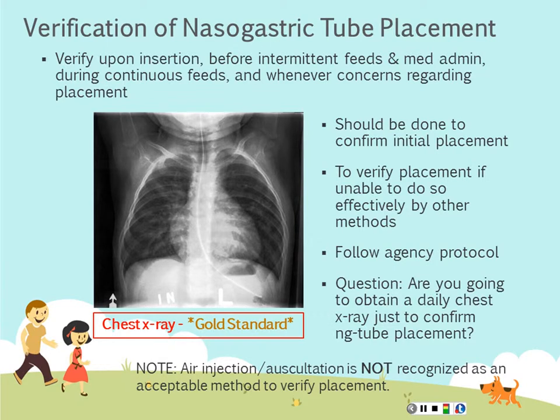The chest X-ray is considered to be a gold standard when assessing placement. It should always be done to confirm initial placement, and then to verify placement if you are unable to do so effectively by any other methods. Different agencies have different protocols following this, so before you perform any skills in the clinical setting, you should always look and see what the hospital's policy is and make sure that you're following their policy.